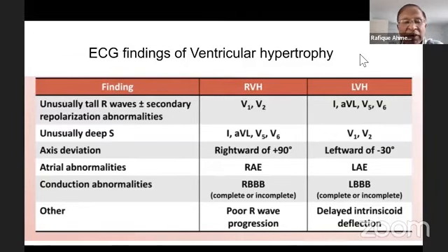Number two, AV conduction can be accelerated. And rarely you can have a nodo-fascicular pathway to make the PR short. So that's about it. I just reported it as a finding without making too many comments. We have to be careful about over-interpreting something.